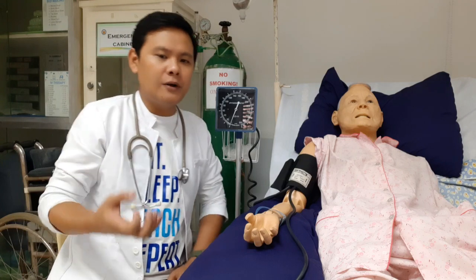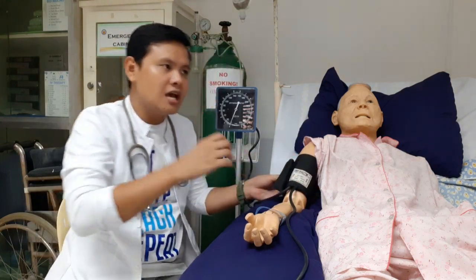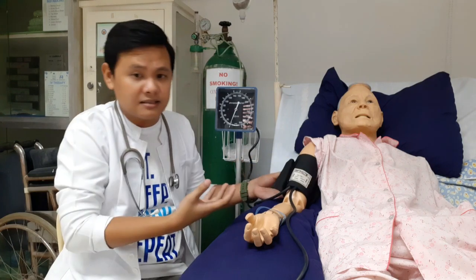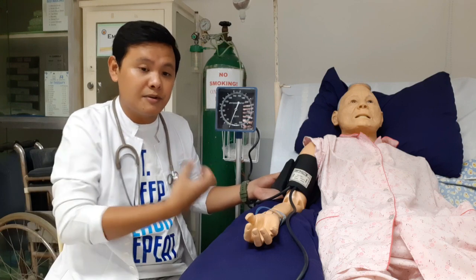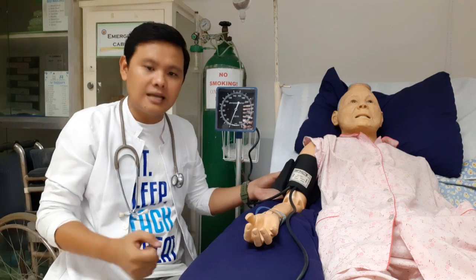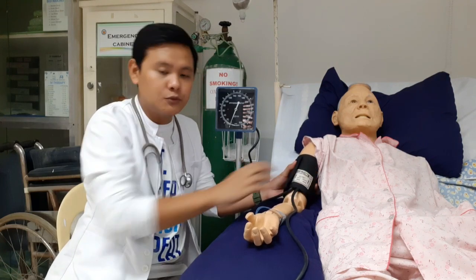Next, you have to wrap the deflated cuff. Kailangan deflated po ito. Wala dapat hangin because if there's a presence of air inside the cuff, the BP result might change. So kailangan you have to wrap it deflated evenly around the arm.